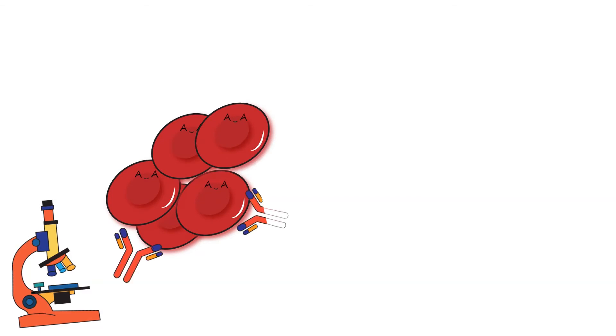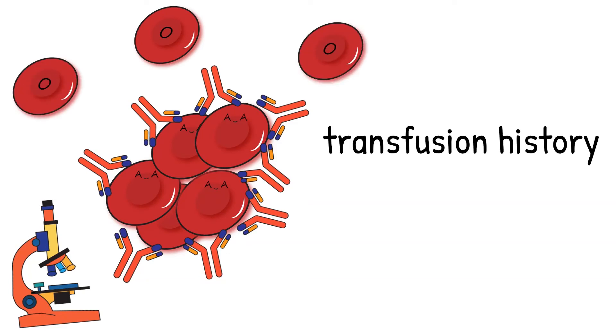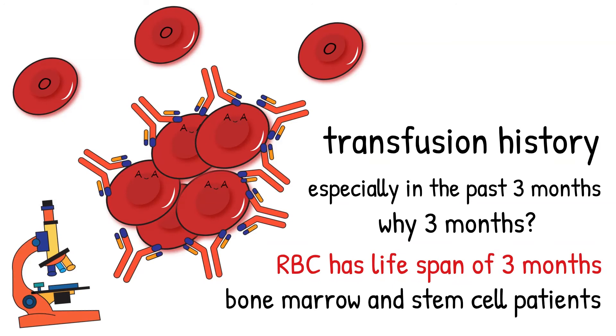Most of the time, we can see this when a non-group O person has been transfused with group O RBC. This can be solved by asking patient transfusion history. We generally ask if the patient has been transfused within the past three months. Why three months? It's because red blood cells has lifespan of three months.